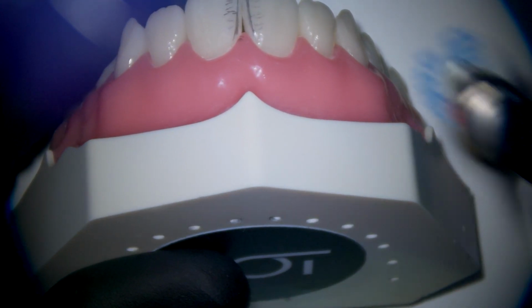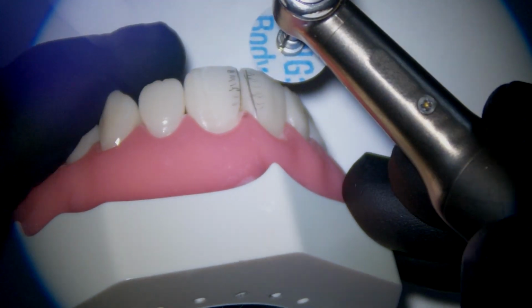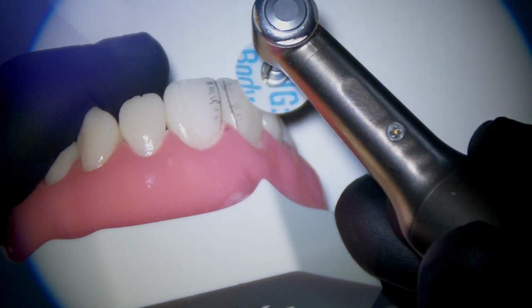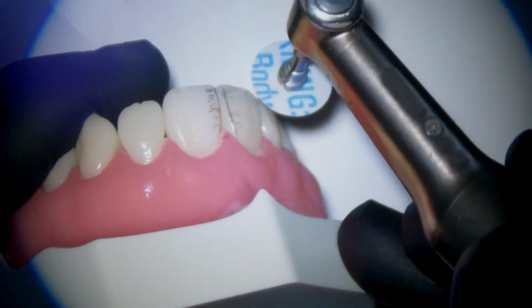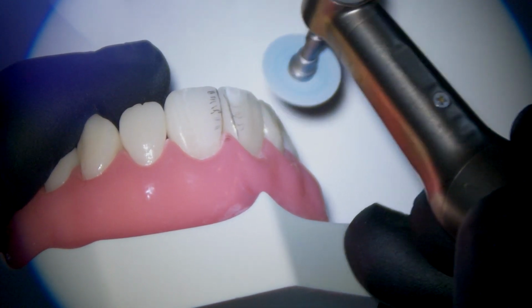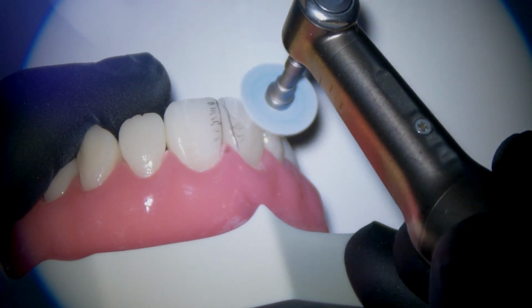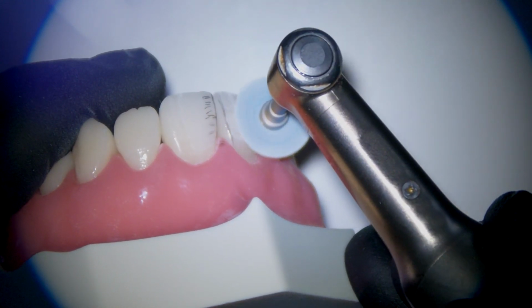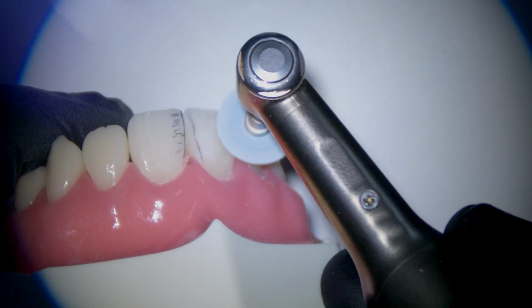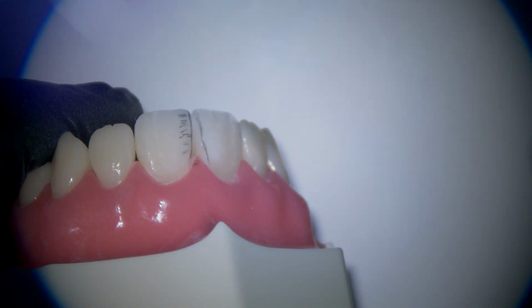To begin my coarse contouring, I'm going to use a medium size coarse disc. The cutting surface of the disc is away from the handpiece, and I'm going to be moving the disc from composite onto tooth surface, running the disc at around 3,000 to 4,000 RPM. You can see there's a slight flex to the disc. And I'm looking for that white line where the composite ends and the composite dust is settling. You can see a little pit right here that I'm working on.